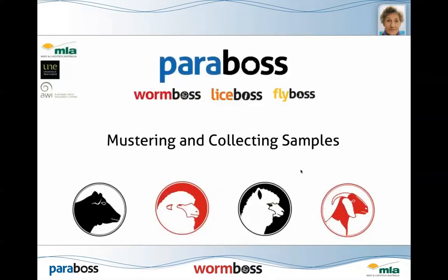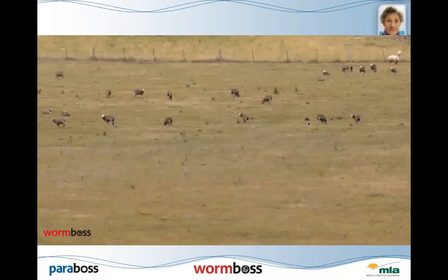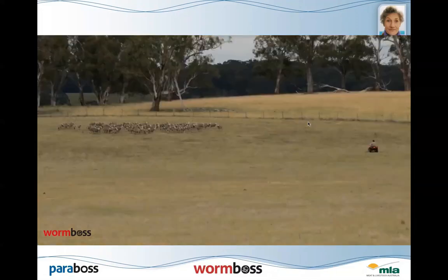Now, I said I'd show you a bit of a video. Unfortunately, WebEx's not too excited about videos, but we've got an animation just showing you some photos so that you can see what's involved. So the first thing, you go out to your paddock, your sheep are out there grazing, approach the mob, and they'll run into a group.